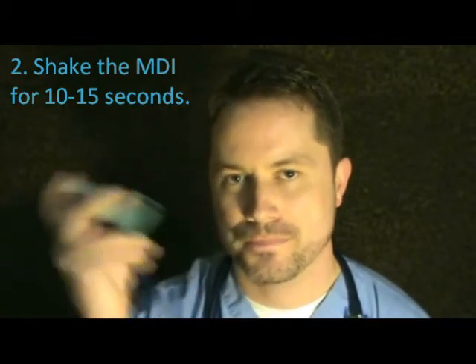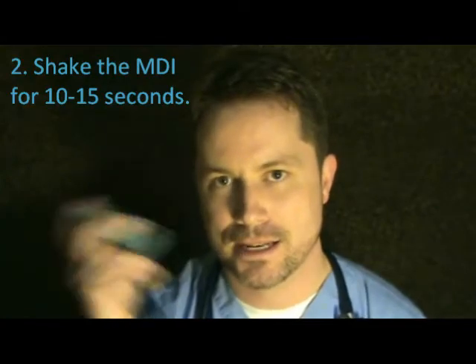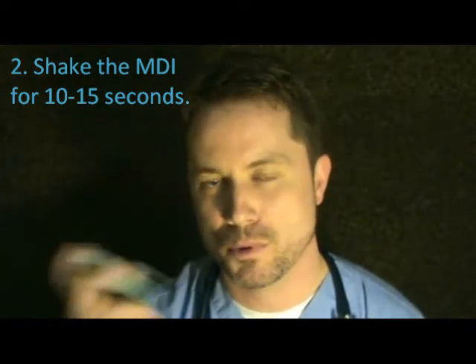Get your canister and shake it for about 10 to 15 seconds. That's going to mix the propellant and the medication. If you don't mix it up, those puffs are pretty much only going to consist of the propellant, and the treatment's not going to be that effective. Whereas if you mix it up, it's going to have a good mixture of medication. You're going to get as much medication as you can.